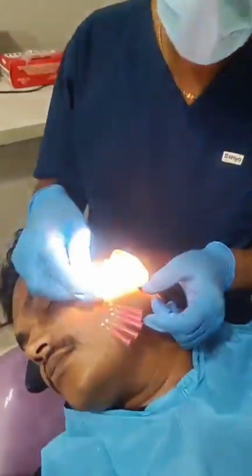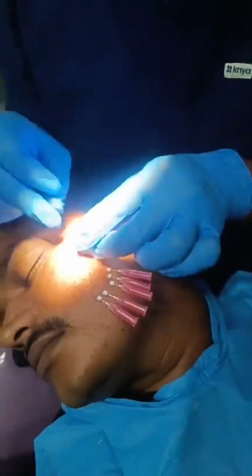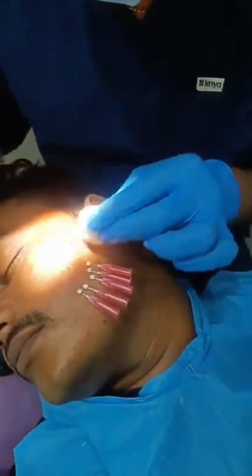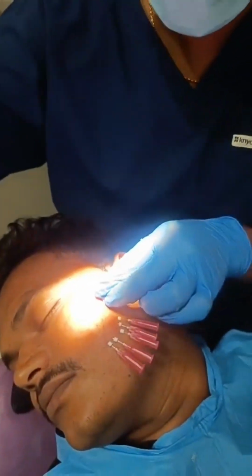Same way, mild bleeding is there, and that also got arrested. Only one has a small twig that has come out. We inserted almost 5 threads, but only one small twig has been popping out, a very tiny one that you can just cut off.